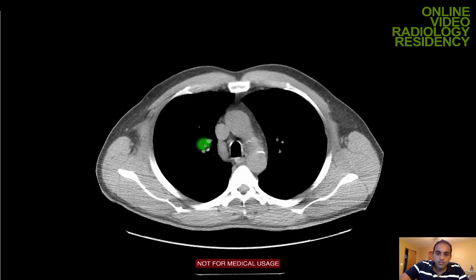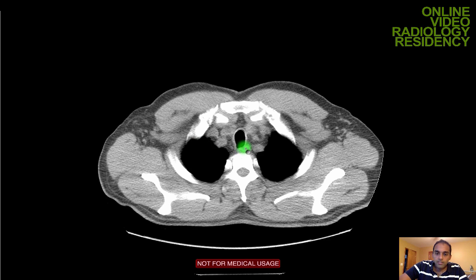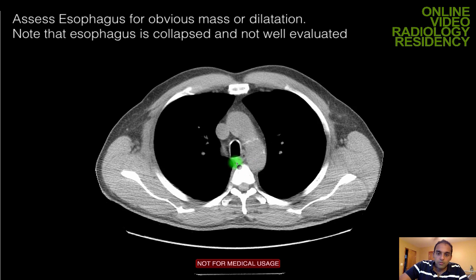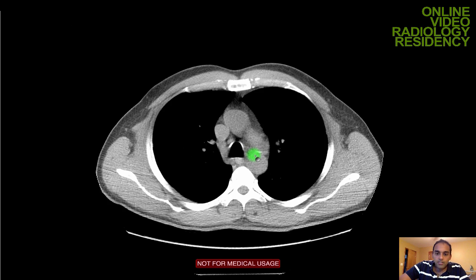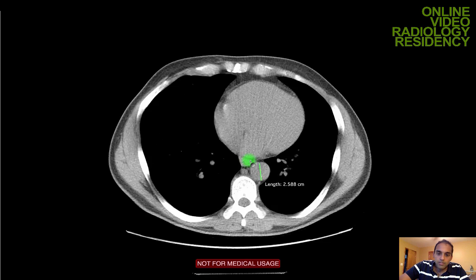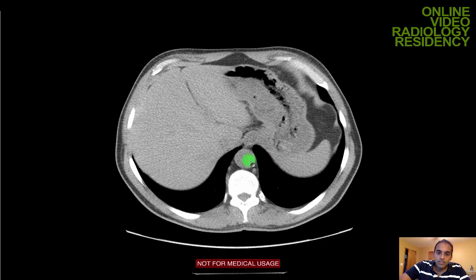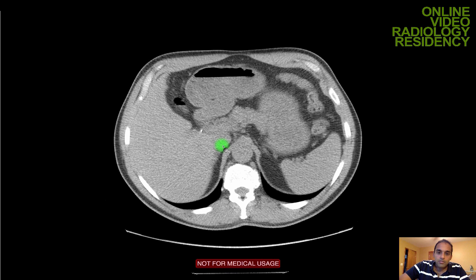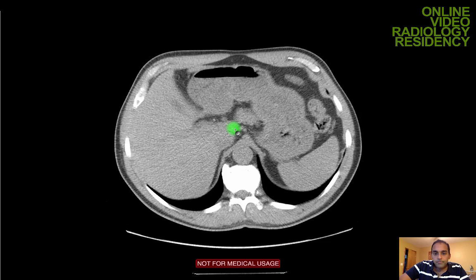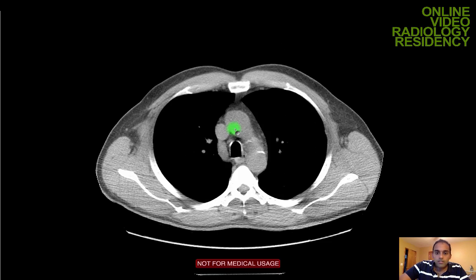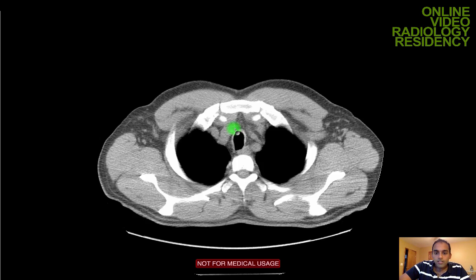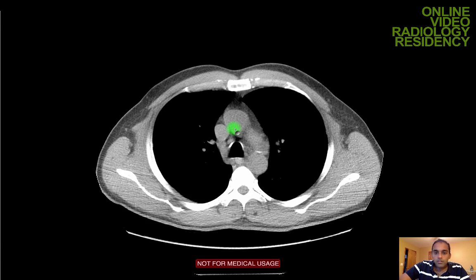Before closing the case, I look at the esophagus — which is collapsed — just to check for any obvious masses. I also come down and check the abdomen for any findings using a search pattern like I use for CT of the abdomen and pelvis. And that's basically it — a basic search pattern for looking at a non-contrast chest CT.